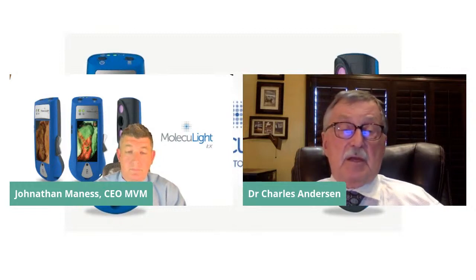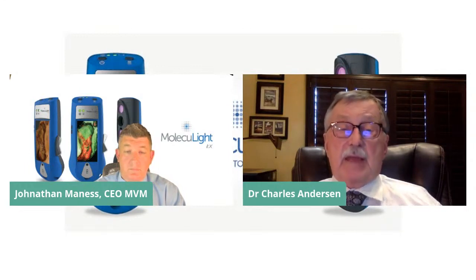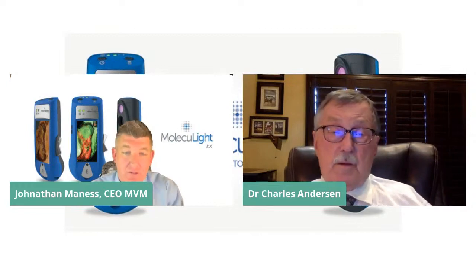And it's not a substitute for a good history and physical, and it's not a substitute for a good wound assessment. Certainly not a substitute for debridement. But to gain that additional information and make that part of your workload, it's very easy and not time consuming at all. And one thing that I want to hit that we didn't really dig in too much, I don't think. Can you please talk a little bit about the history of the wound that you're able to capture with this device and how that is important as you carry a patient through, you know, 5-10 years?